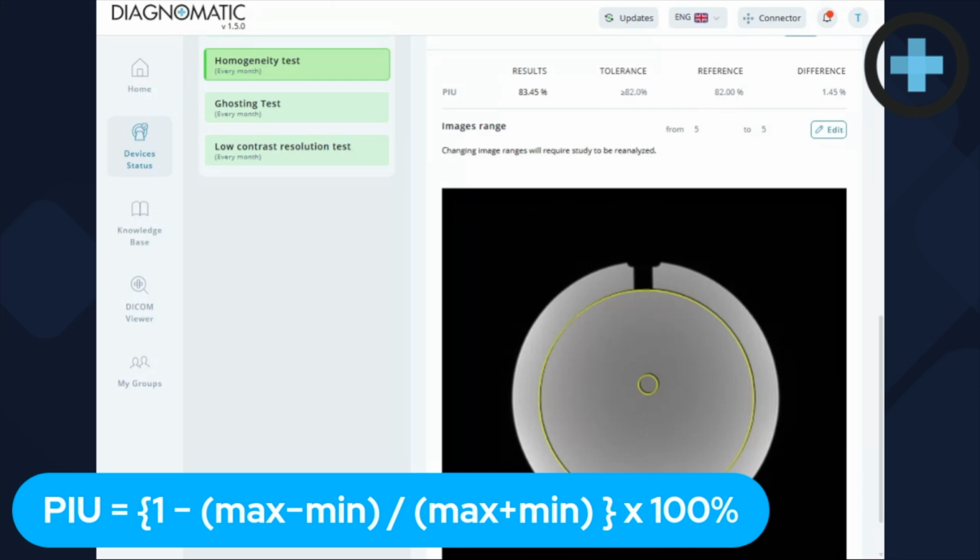Question: are the reference values of the test table results from commissioning values of the ACR scanners or the ACR minimum values for accreditation? This is all based on the ACR accreditation, what they require if the facility wants to get ACR accreditation. Commissioning values may vary for various countries. This is just strictly for accreditation, so it more so affects those in the U.S. That answers your question, Sarah.